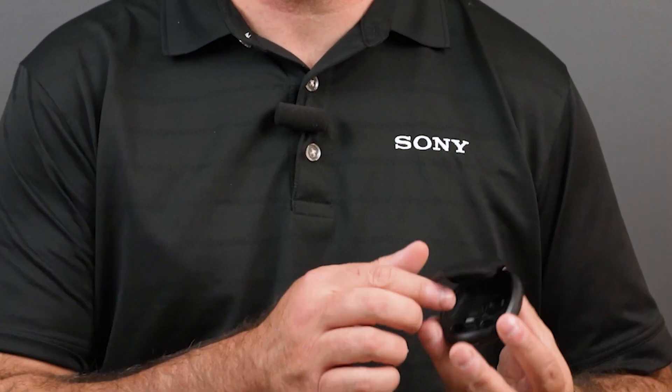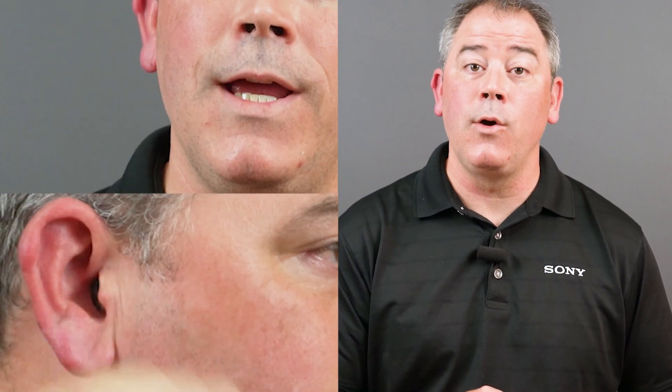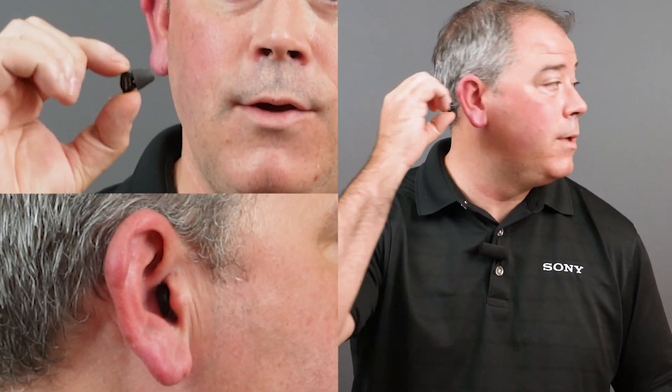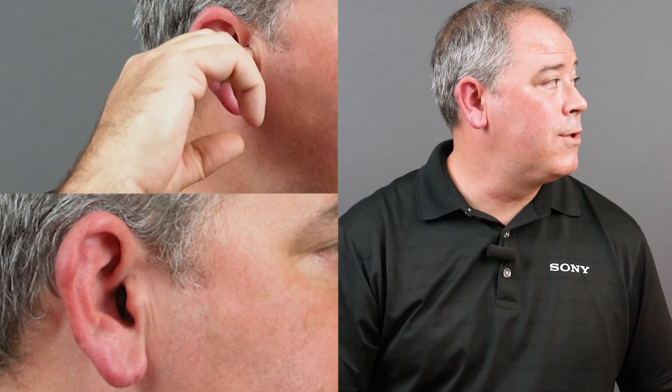First, open the case and take out the right hearing aid, hold it between your index finger and your thumb and simply insert into the ear canal. It should feel snug, but not too tight or uncomfortable. How does it feel?